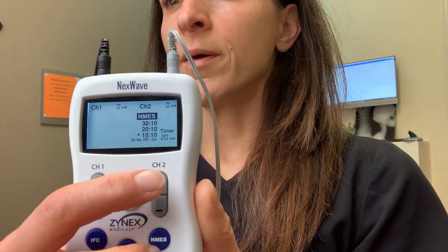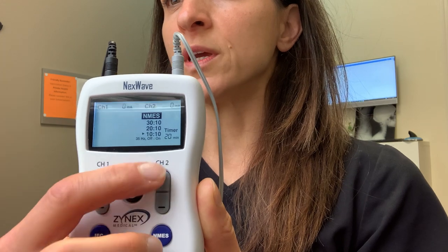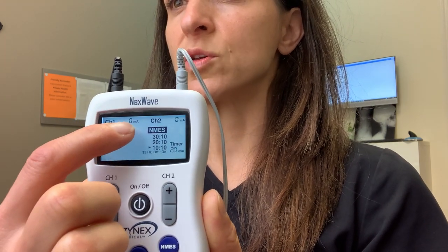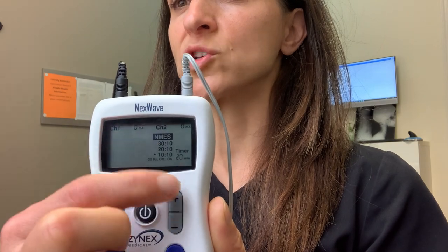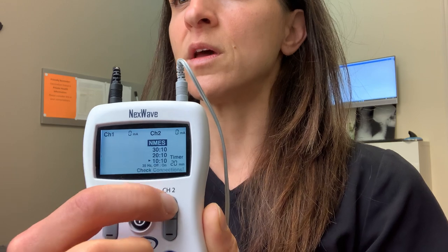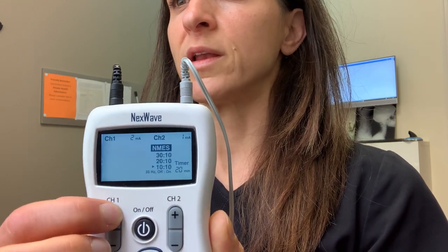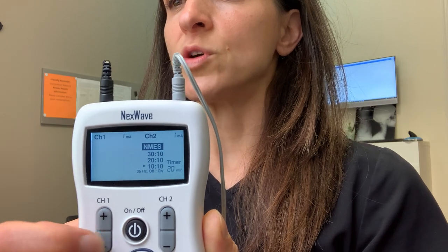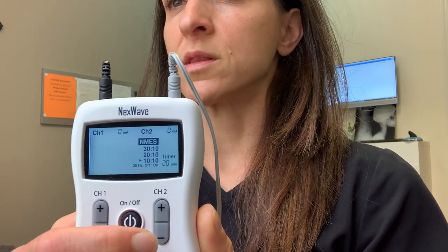Once you get the leads set up, these are the buttons you're going to use to increase the intensity, and you'll see the change in intensity displayed here — these numbers will start to go up once you increase. As I push it up, each lead will then increase. But for now, we want those at zero. You don't want any current running through when you're trying to set the pads up.